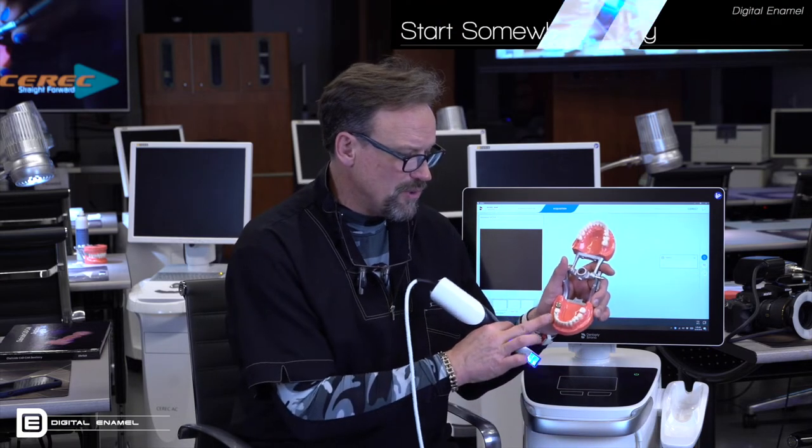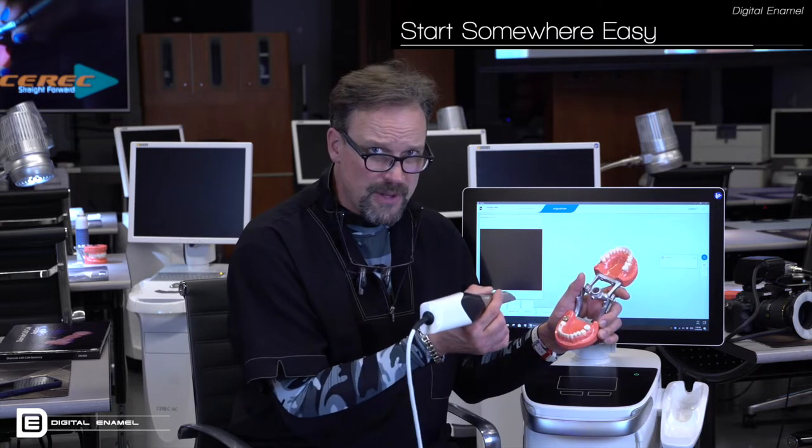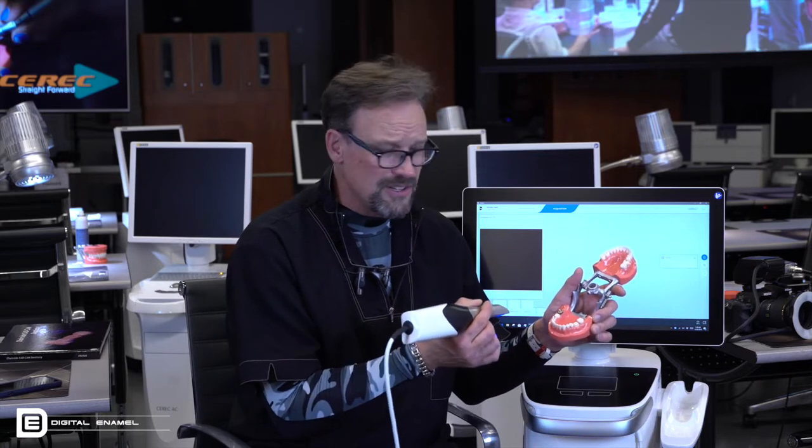My first suggestion is find a good starting point. Now, if you're using the button, you may want to go all the way to the back and then kick it on. But what I'm going to tell you to do is start somewhere easy. There's different areas of the mouth that are really, really easy and some that are really hard. Lower anterior teeth, they're really hard, okay? Not that they can't be scanned, but why start on something that's more difficult to image? You could start on the buccal of lower premolars. That's a huge surface area that's really easy to scan.